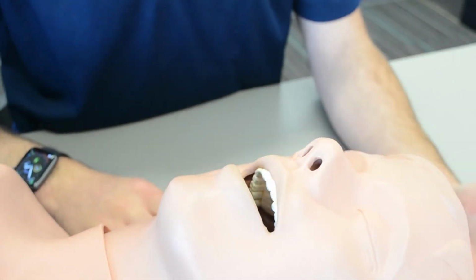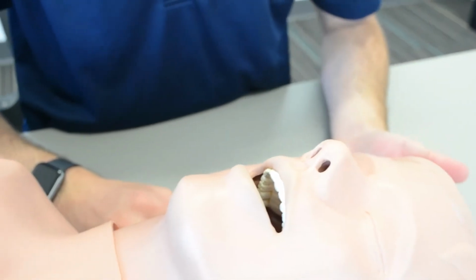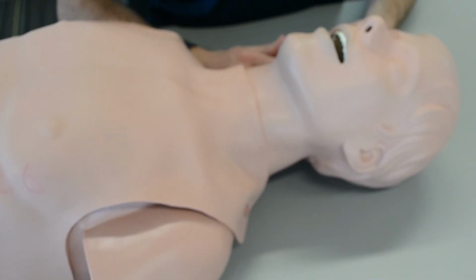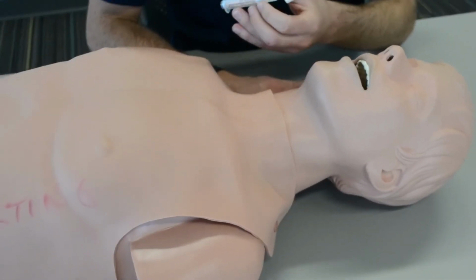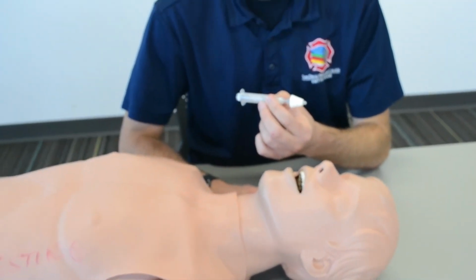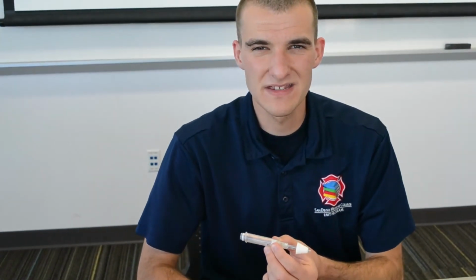We'd wait a little bit, see if it's effective. If we still need to ventilate our patient, we'd be doing it then. The most important thing, though, is to make sure that you give this medication quickly, in rapid succession. That way, it's able to atomize and be properly delivered. If it's given too slow, it's just going to dribble out, go to the back of the throat, and it's not going to be used at all.